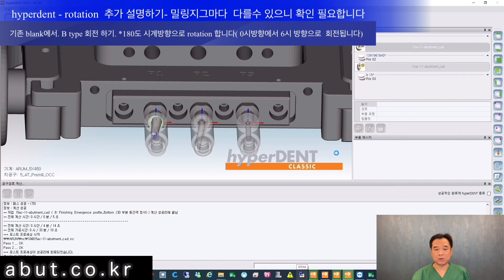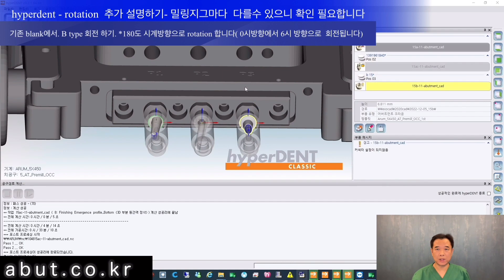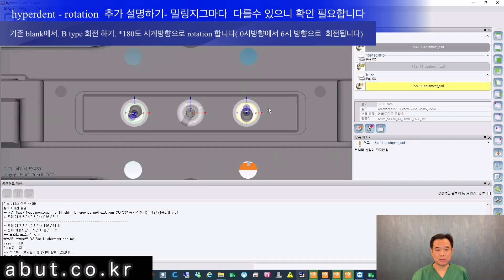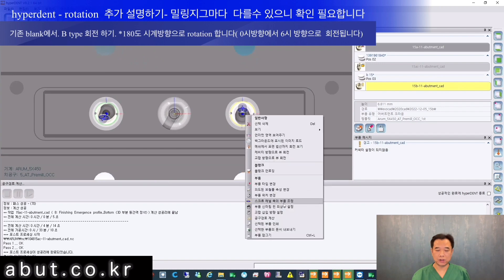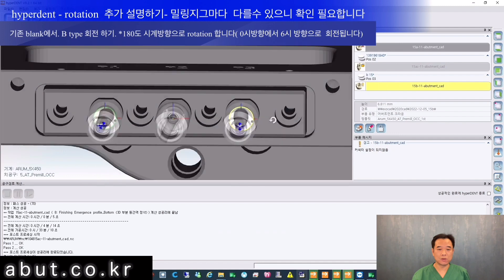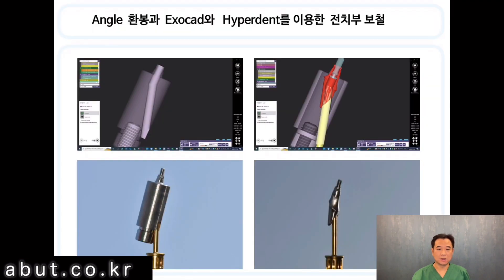For Type B, rotate 180 degrees clockwise so that it will be facing the 6 o'clock direction. Select 180 degrees and press clockwise rotation. The angles can be different depending on the equipment you own, so it's important to check this by rotating and comparing with the milling zig.